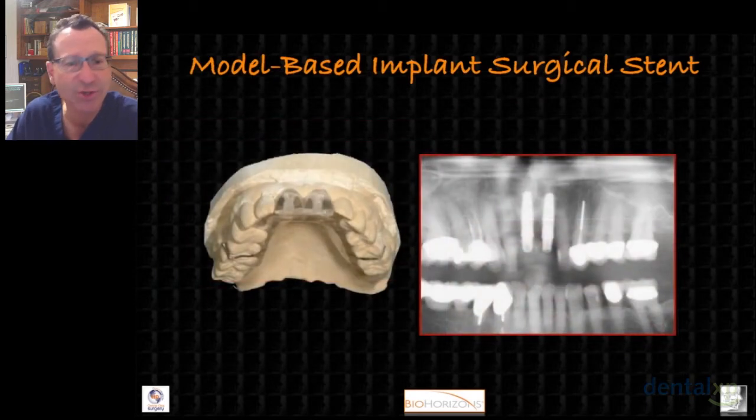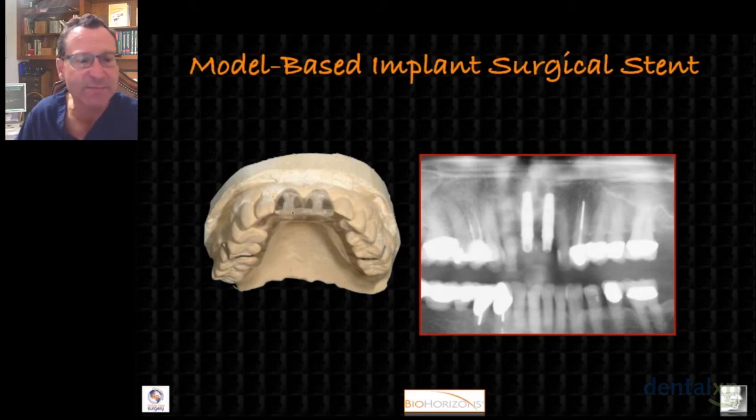And so we had a surgical guide made. We got study models, had a surgical guide made from wax ups where we have the channels through the pontics indicating the path of the long axis of the implant coming out in the cingulum area for these central incisors. And you can see on the right here that our post-op film, or actually this is our second stage film, when we place the provisional abutments, is that the implants are nice and parallel, they're nicely spaced, and that this is a nice aesthetic and functional result.